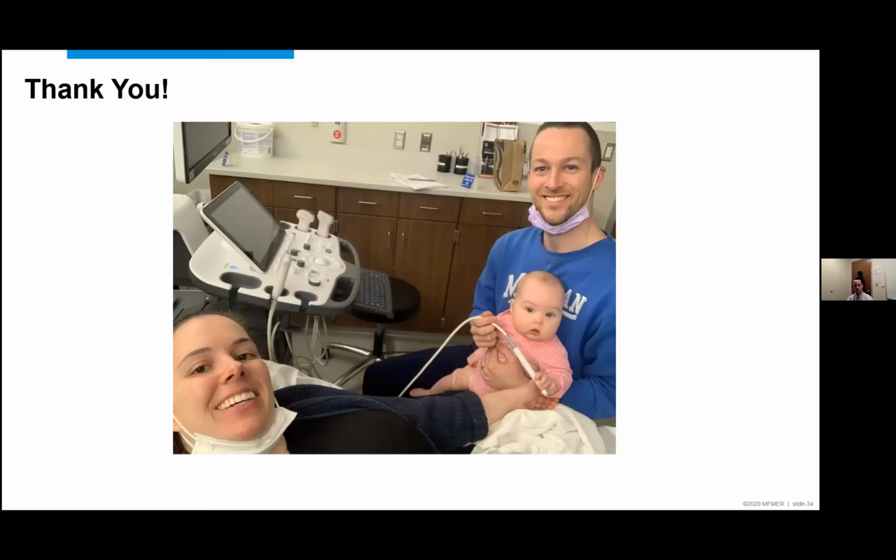So for me, with the dorsal wrist, similar to what you did, yes, we always talk about Lister's tubercle, and yes, that is a great home base, and I will usually find that first before going into my evaluation of the dorsal compartment tendons. I will flip and take a look at the radiocarpal joint first. And like I said, I think you can get a lot of valuable information from that. You can look at the dorsal synovial recesses, look for an effusion, look for synovial changes, hyperemia, that sort of thing. Again, that will clue you in to this potentially being something intra-articular versus not.